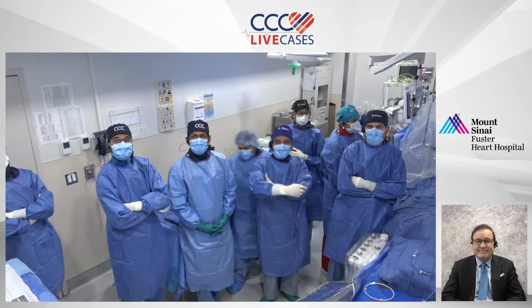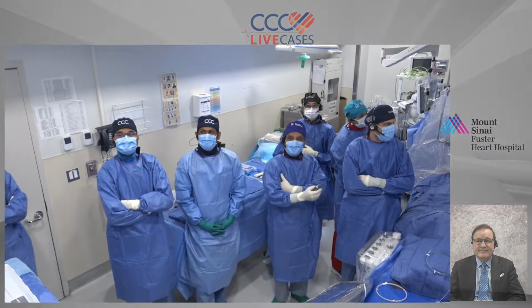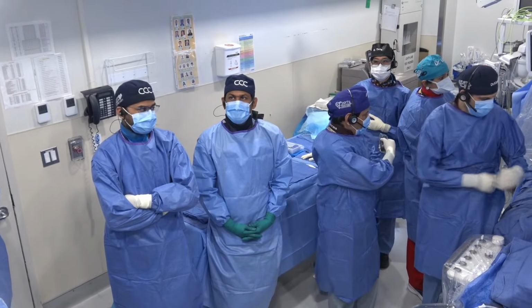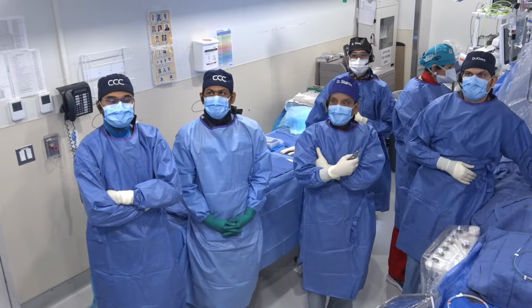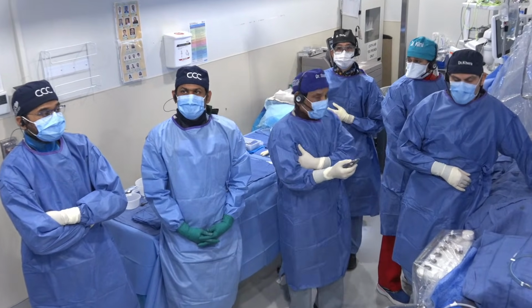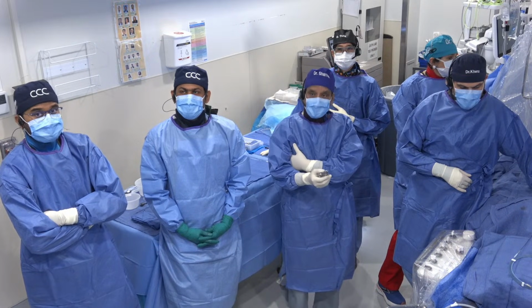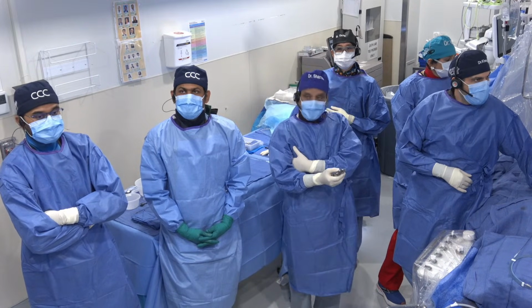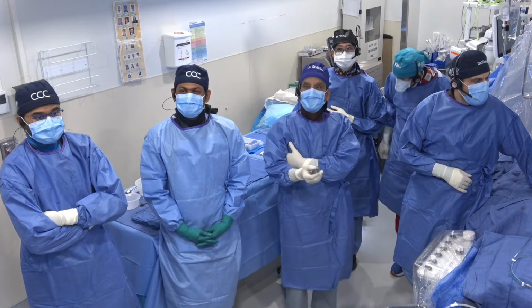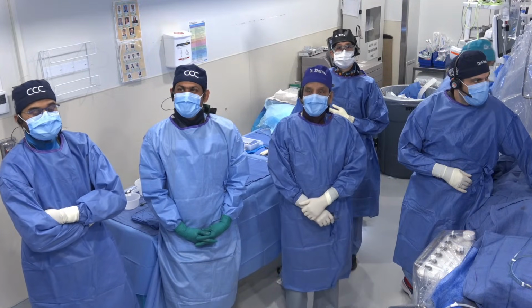All right, Pedro, thank you. And of course, welcome to our viewers of the structural heart program, which is also increasing in numbers, and we thank all of them. And the crew is basically the same: Dr. Tang, Dr. Keeney, Dr. Khera, myself, and we have 2 fellows here. We actually have a total of 4 structural interventional fellows, but it will continue to be 3 in the future. They are very helpful in arranging the cases and able to do all the cases. Many of them are aortic TAVR cases, but of course, there is a lot more to learn in the mitral and tricuspid space.